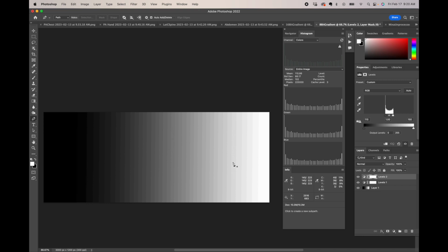But if we continue on to the next view thinking our technique's right on, and it's not, and we're giving too much dose to the patient, then it's a disservice to the patient, but also to the radiologist, because if we've created issues with a file like this in the histogram, it ultimately creates noise, something that, as we're taught in radiography, is called quantum mottle.